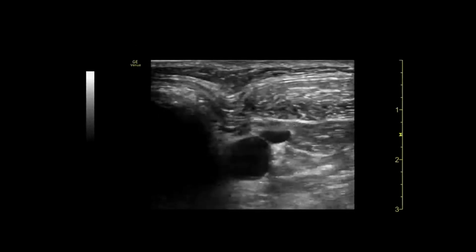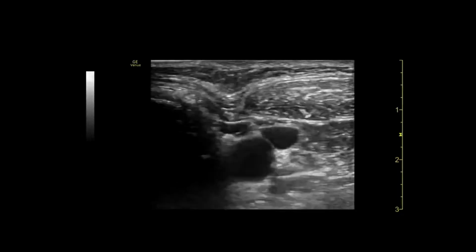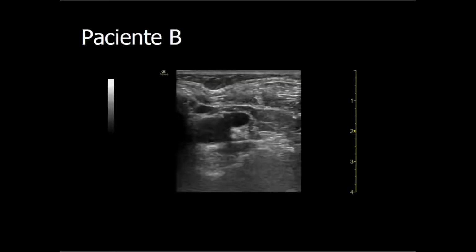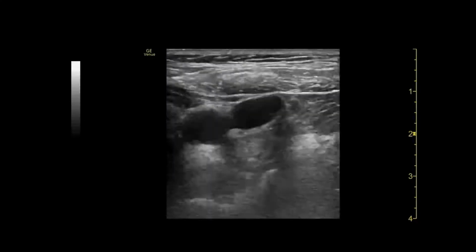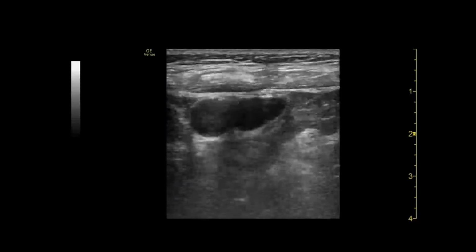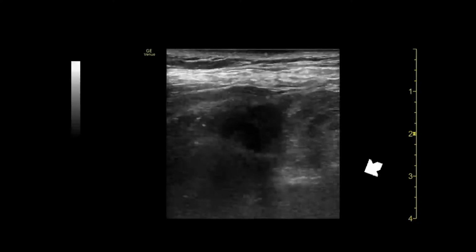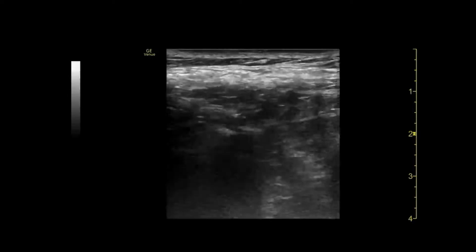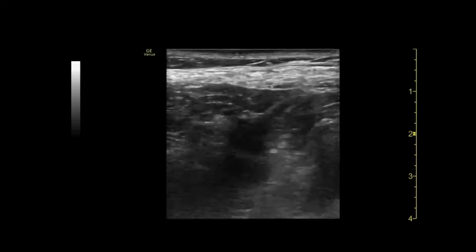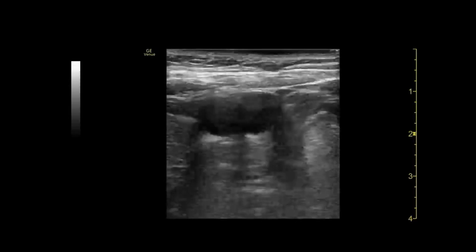In this case, again, you see a small jugular vein and, it looks like, an anterior jugular vein as well. So 2 veins. And in this patient, we'll again scan. We're moving down towards the clavicle. And you see the vein is very lateral. And you see the subclavian artery, that arrow there, it's ghost looking. Now very difficult to see here. And we're moving again back up in the neck.